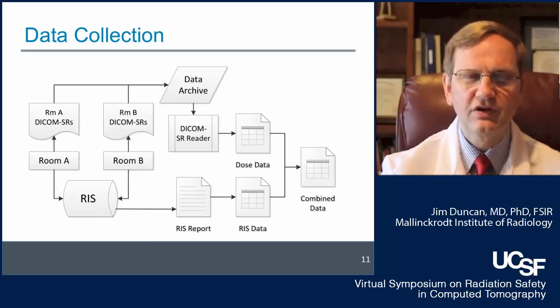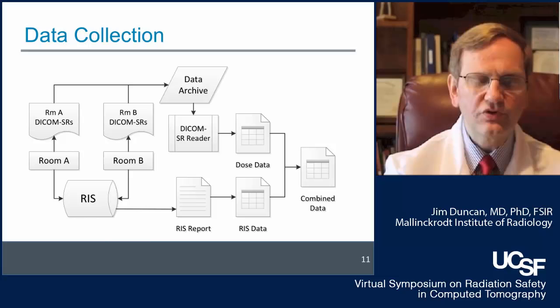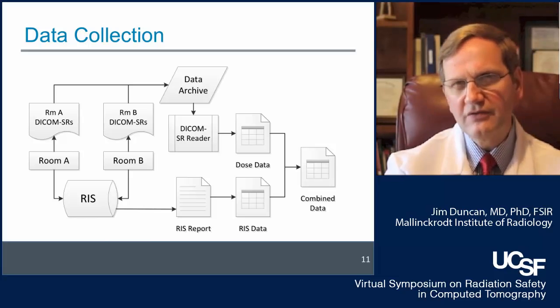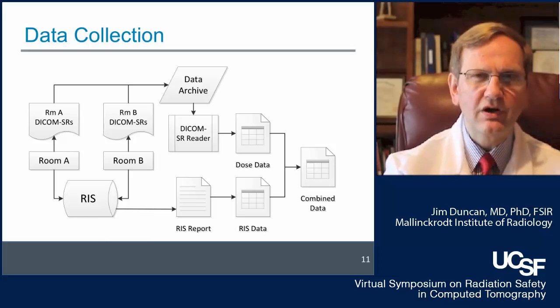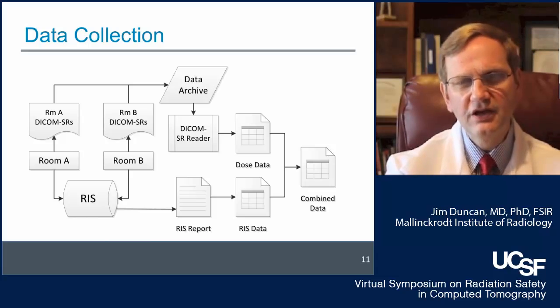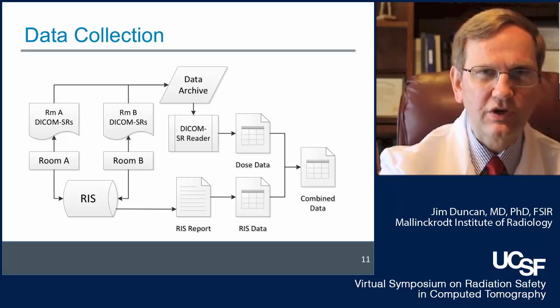It tells us who was part of that procedure, who was involved as primary and secondary operators, and also the technologist, supplies used, what room. There's an incredible amount of information captured in the RIS, and now we have a process where we combine dose reports with the RIS data and use that to calculate those expected ranges.